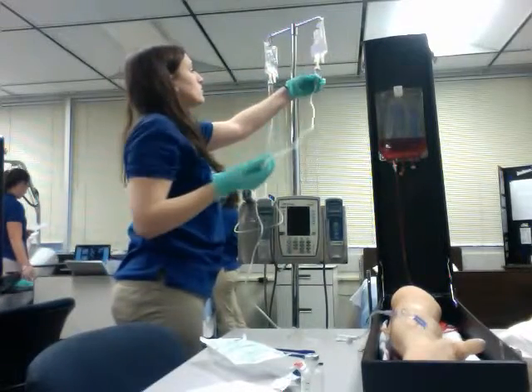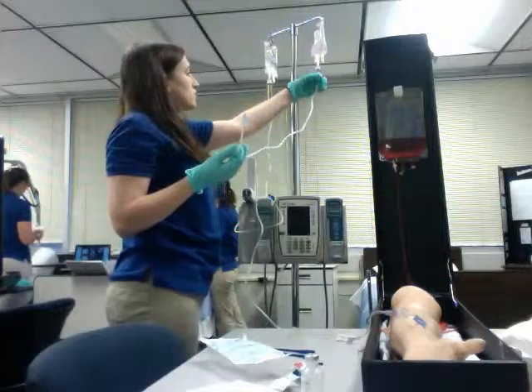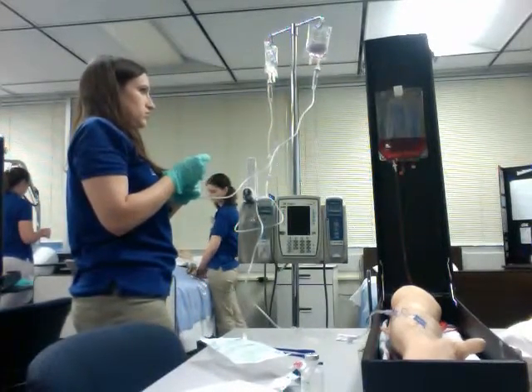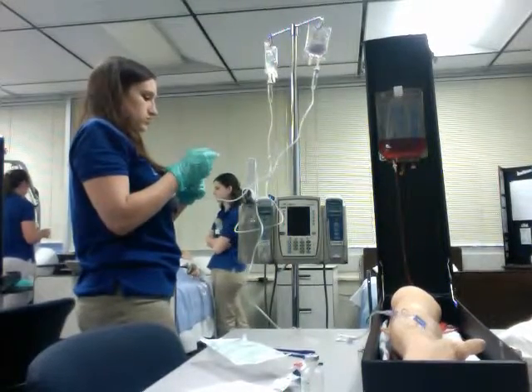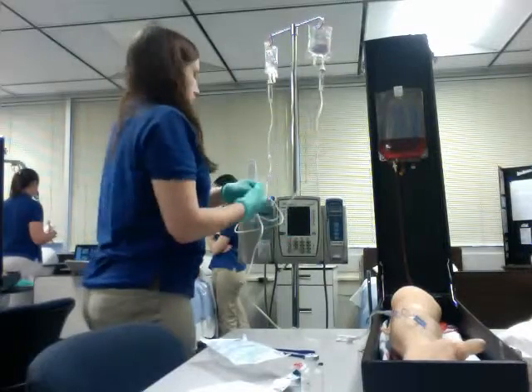And I'm going to prime the drip chamber. So it's 56 milliliters over 1 hour. So it's 56 over 1 times 1 over 60 times 15 over 1. And that would be 14. That's all set.